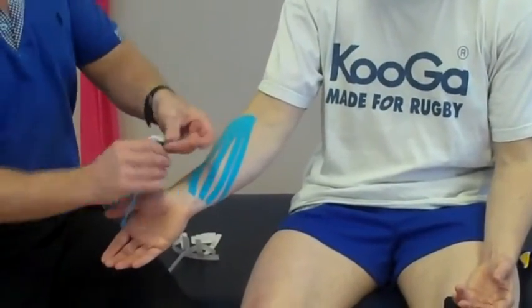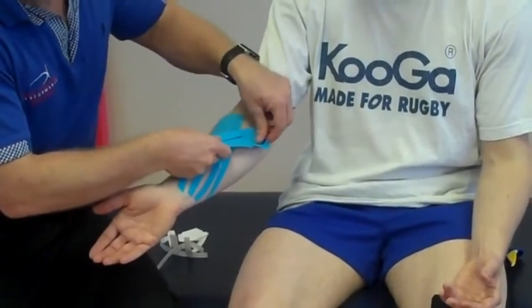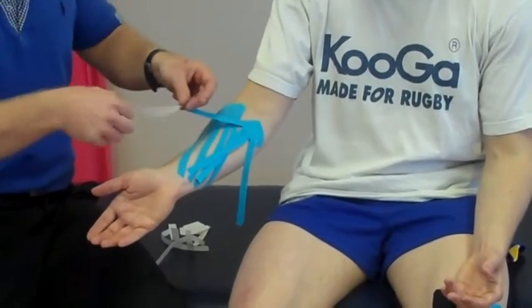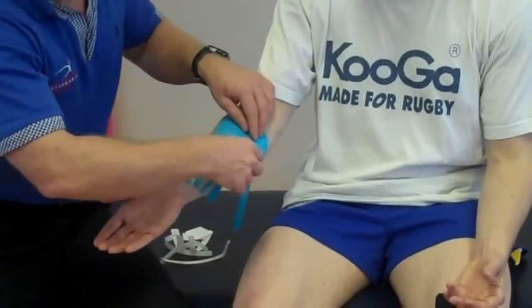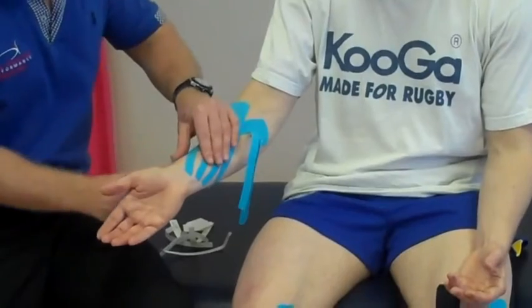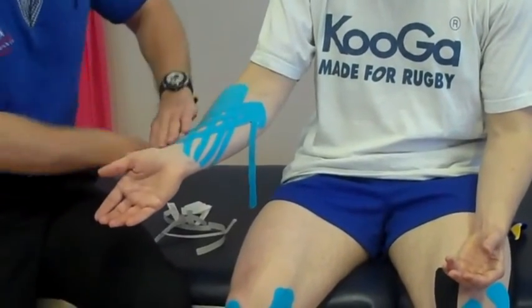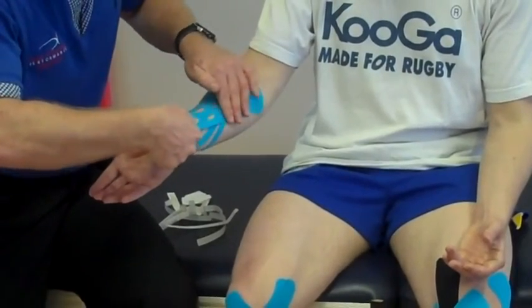Then the second fan strip — place it on the medial side. With each of the legs you can just peel and come across the first I-strip that's been cut, and apply the last one.